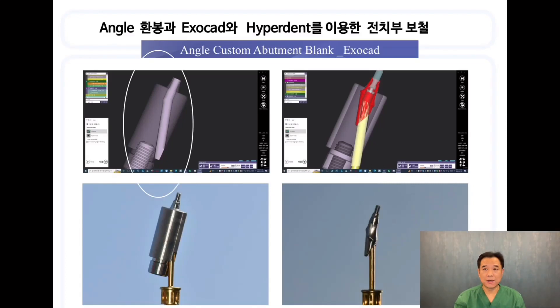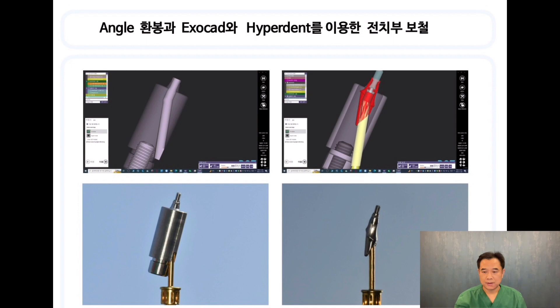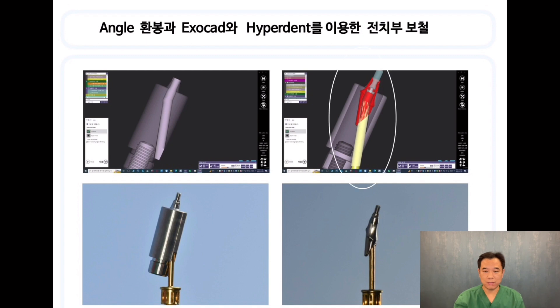We will look at anterior prosthodontics using an angled custom abutment blank and Hyperdent. We need a custom abutment blank with an angled screw channel. The angle driver fits into this screw hole. Exocad is used to complete the design to look like the red abutment. After making the NC file using the KM program and machining it with the milling machine, the angled hole abutment is produced.